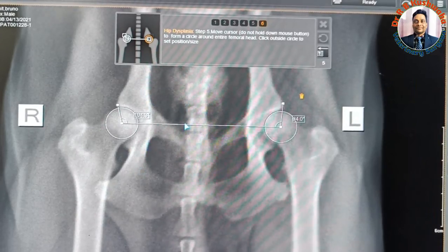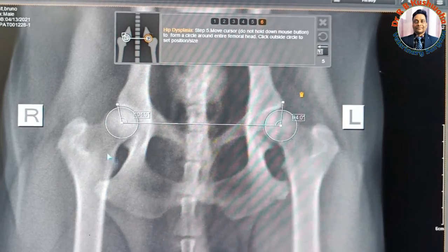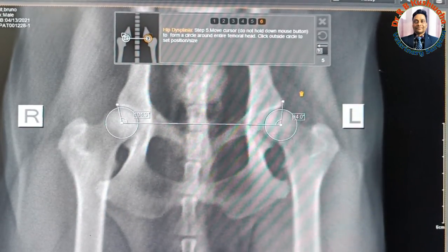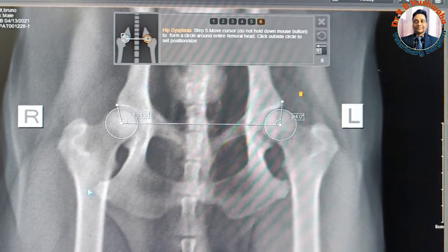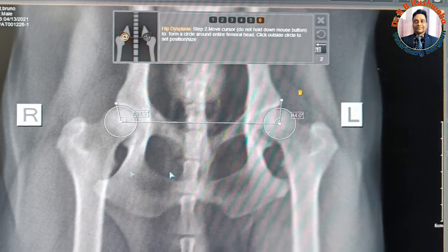One thing is very, very important before measuring the Norberg's angle: both femoral heads should be extended and parallel to each other. Otherwise, if the two femoral heads are not parallel to each other, you may get the wrong value.